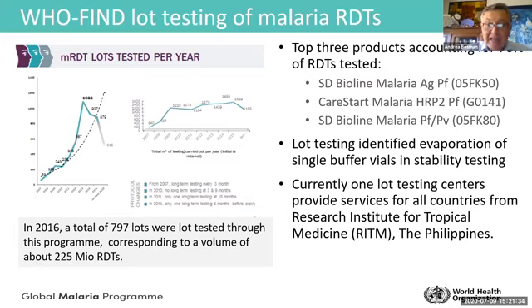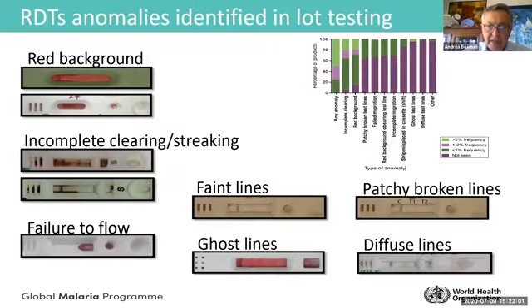It's possible to take some of these tests in some boxes and send them to the WHO collaborating center in the Philippines, where they are tested through this procedure. When they receive the tests, after 5 working days, they are able to give the results, and it is free of charge. So it's something to consider if there is any concern from the field that the RDTs may not be working.